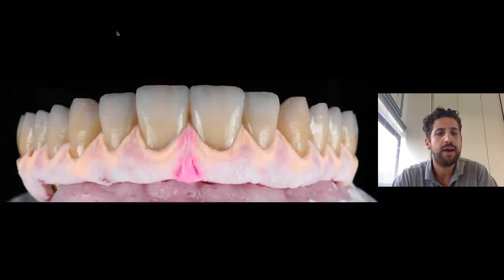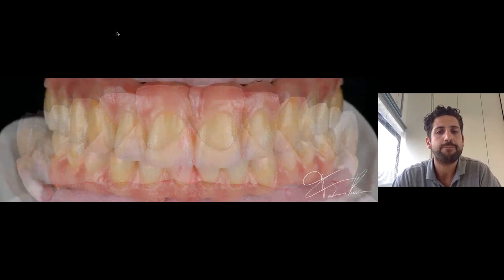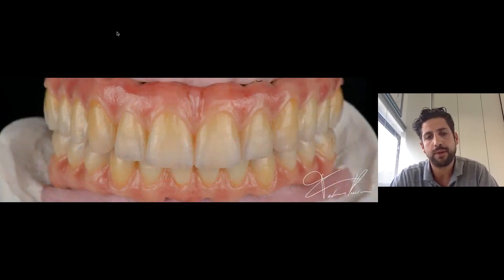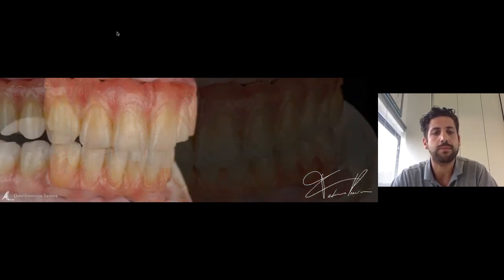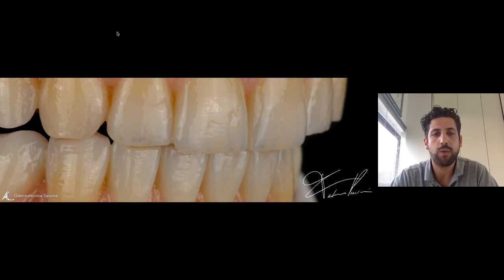We fire, and then we start with our build-up with the masses, with different masses, tissue 4, tissue 5, tissue 3. And this is our result after the glaze. Some pictures in profile. A little bit closer, we can also see a really nice incisal effect just in the full contour zirconia.